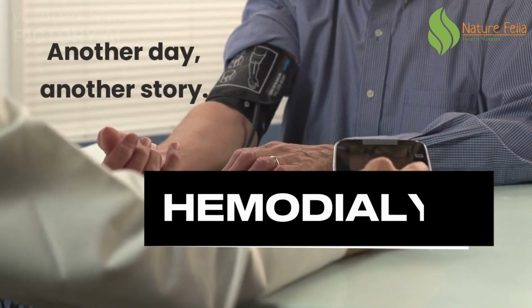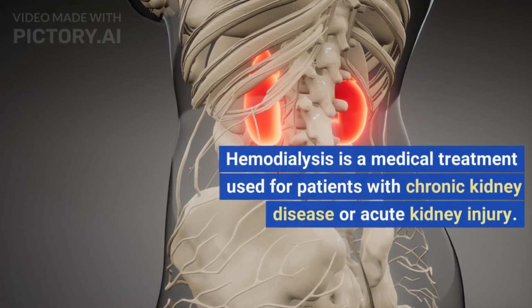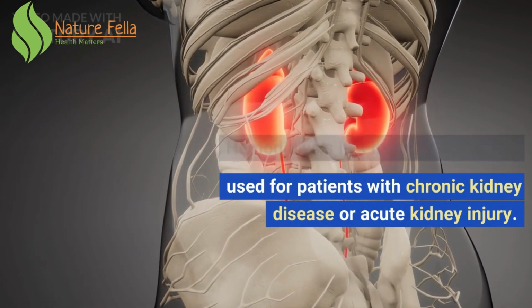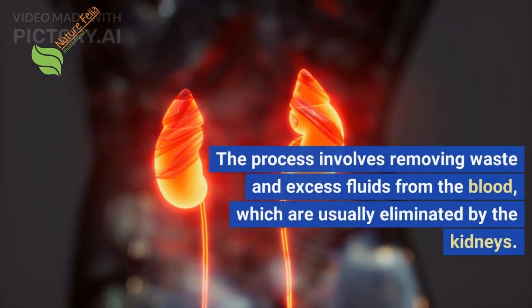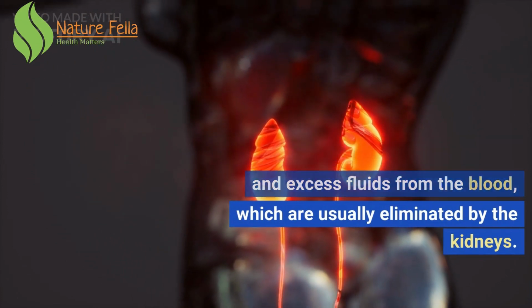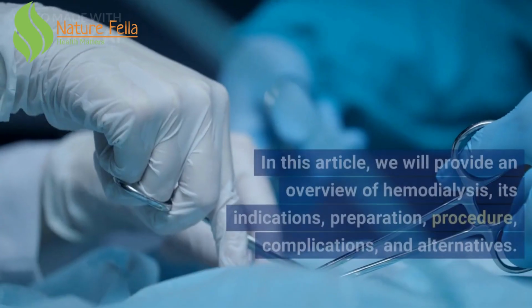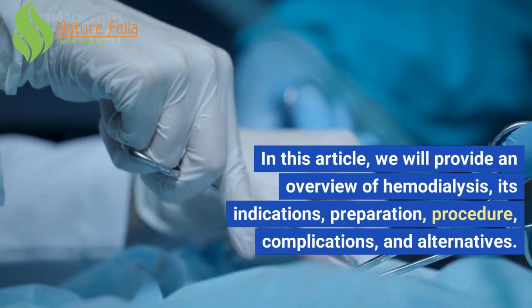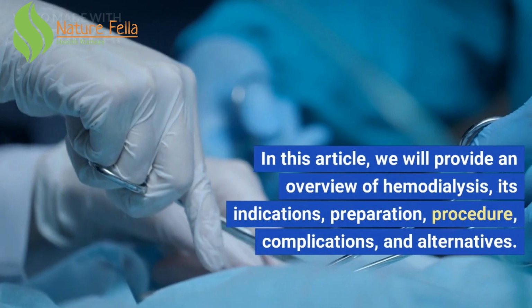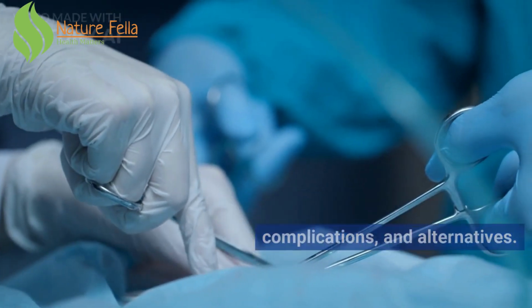Another day, another story. Hemodialysis is a medical treatment used for patients with chronic kidney disease or acute kidney injury. The process involves removing waste and excess fluids from the blood, which are usually eliminated by the kidneys. In this article, we will provide an overview of hemodialysis, its indications, preparation, procedure, complications, and alternatives.